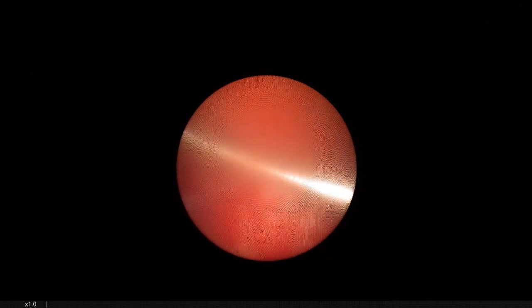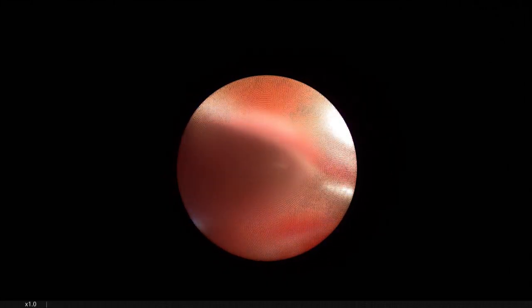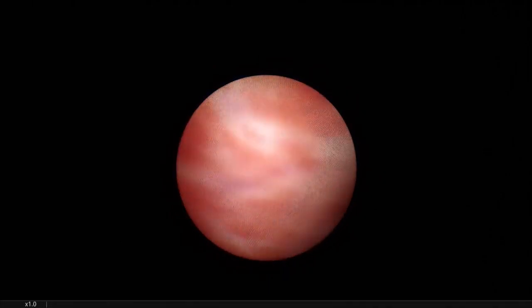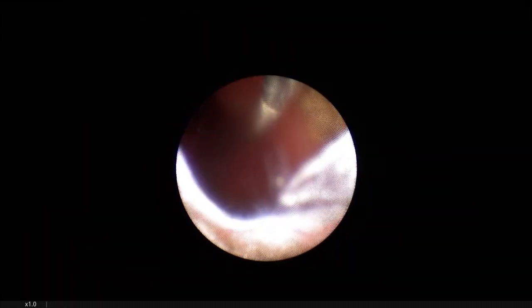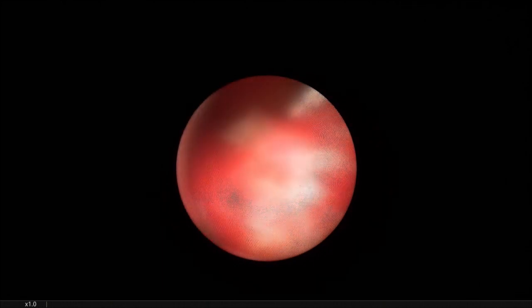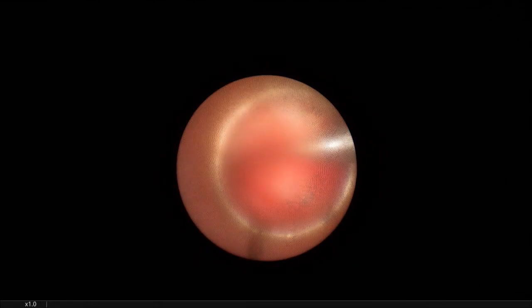Okay, we're inside the calyceal system. There's a stone. Yes, we have the stone. No problem. This was the reason why you asked me to come to Morocco. Okay? Now let's have a look.